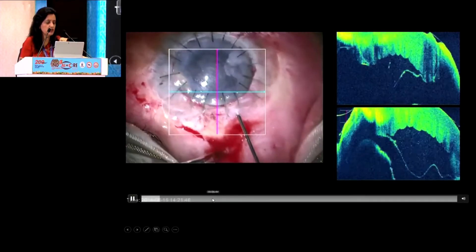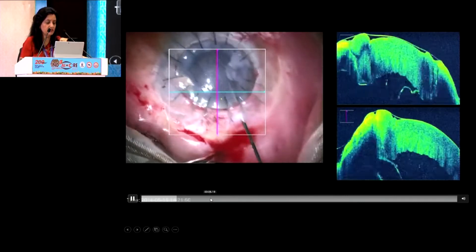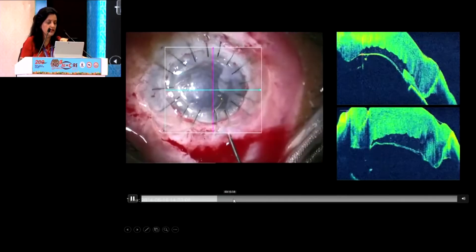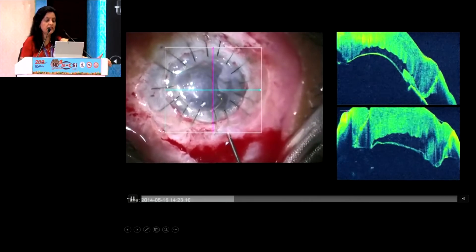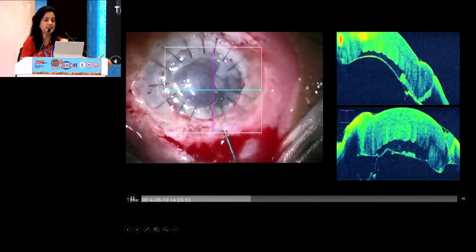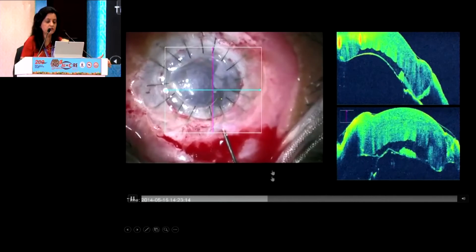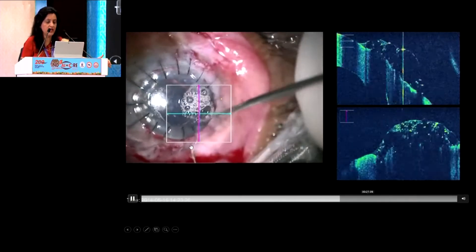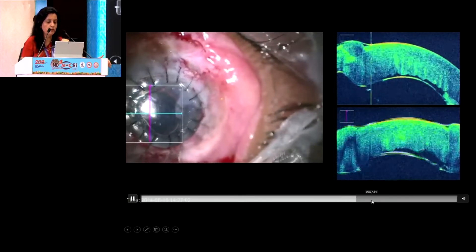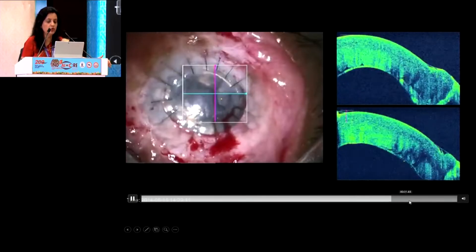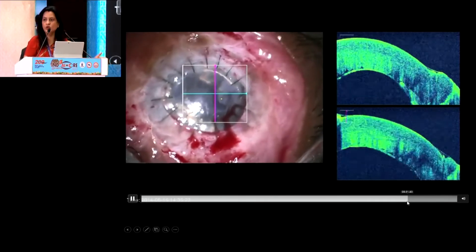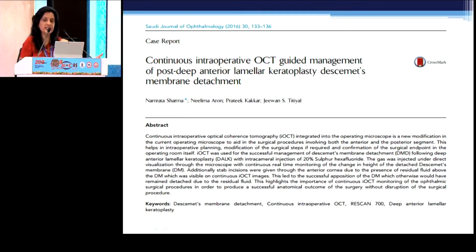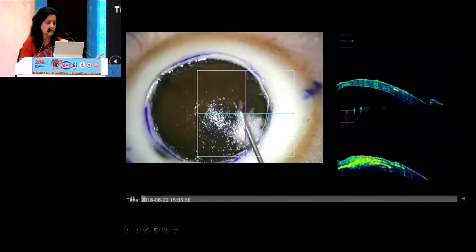Again, in this case — a Descemet's membrane detachment after a corneal transplantation procedure — look at the detachment there. Once you put the air bubble, you would again think you are done because your air bubble is in there, but you are not done because there is some gap still present. So when you go and give those stab incisions there and put that air bubble again, then you know it is pretty well attached and you are done. These subtle things can only be seen on the continuous intra-op OCT microscope.